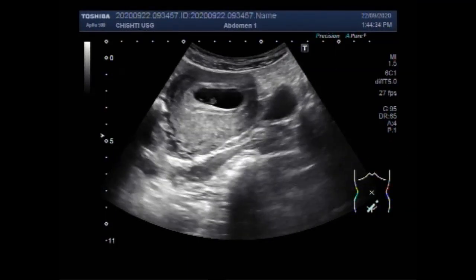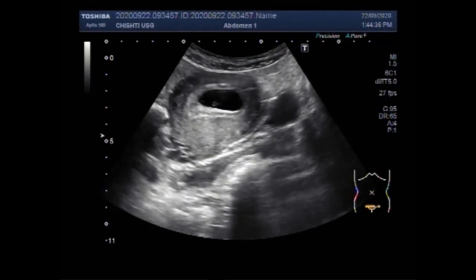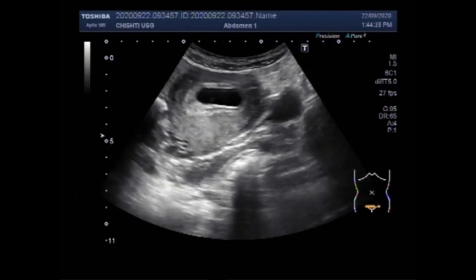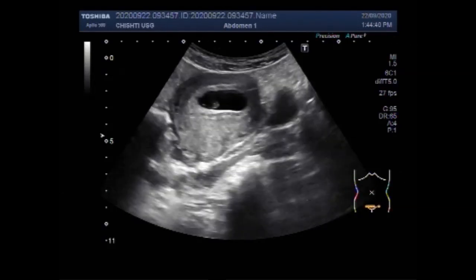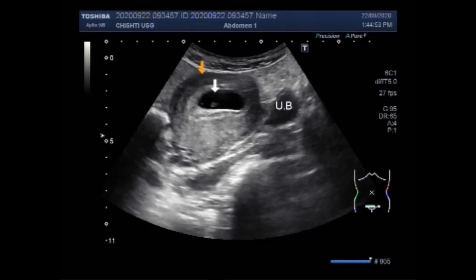Dear viewers, I hope you are all fine. This ultrasound video shows pregnancy with fetal demise and ovarian cyst. You can see this is the urinary bladder, and this is the gestation sac and the uterus having products of conception.